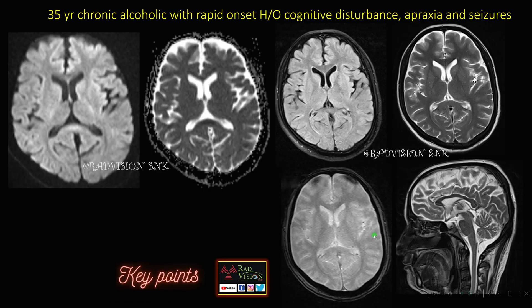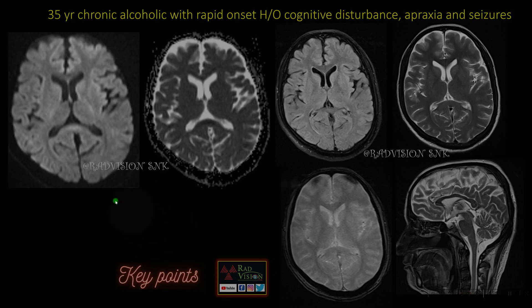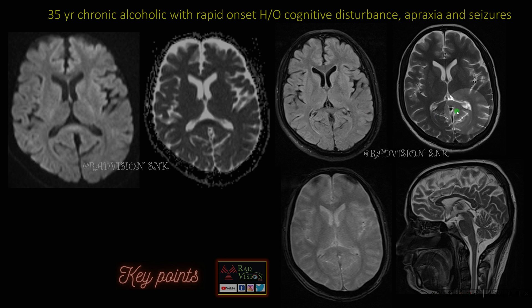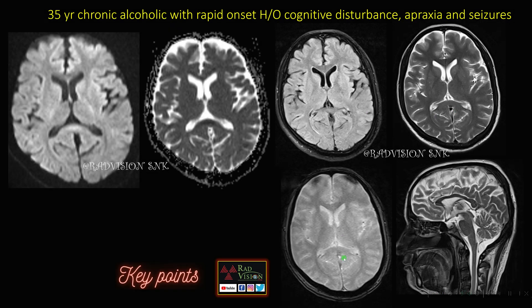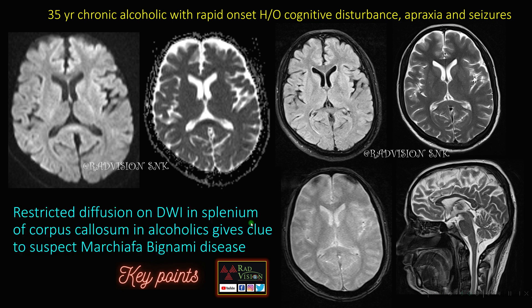Next: a 35-year-old chronic alcoholic presenting with rapid onset of seizures and apraxia. You can see there is restricted diffusion on DWI in the splenium of corpus callosum with low ADC values, and these signal changes are not clearly depicted in the other sequences. Whenever you see an alcoholic with restricted diffusion on DWI in the splenium or in the corpus callosum, definitely suspect Marchiafava-Bignami disease. Restricted diffusion on DWI in chronic alcoholics gives a clue to suspect Marchiafava-Bignami disease.